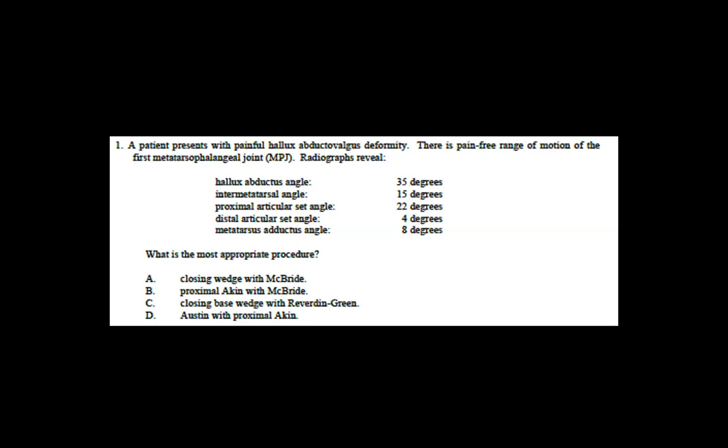But beyond that, we usually just look at how are they compared to a normal image. So is it increased or decreased? I'd rather you know something is abnormal by just saying it's increased or decreased and just forget the actual numeric value, because you at least understand the concept. All right, that was a little disclaimer at the beginning here.